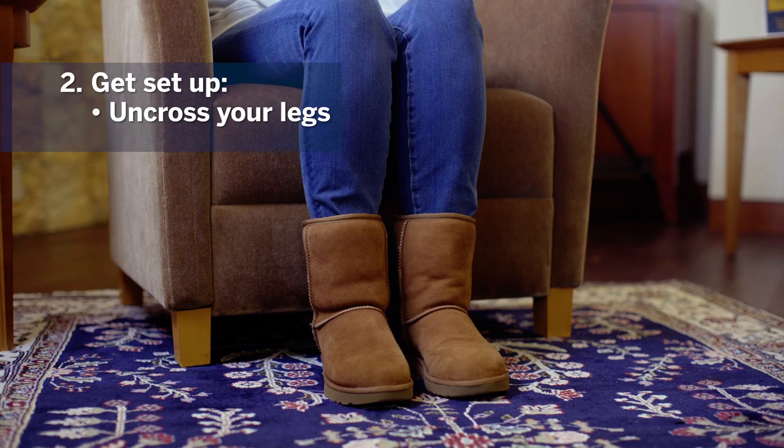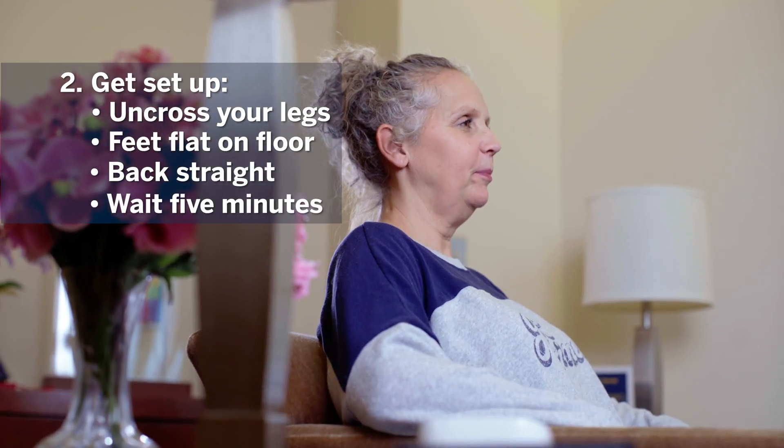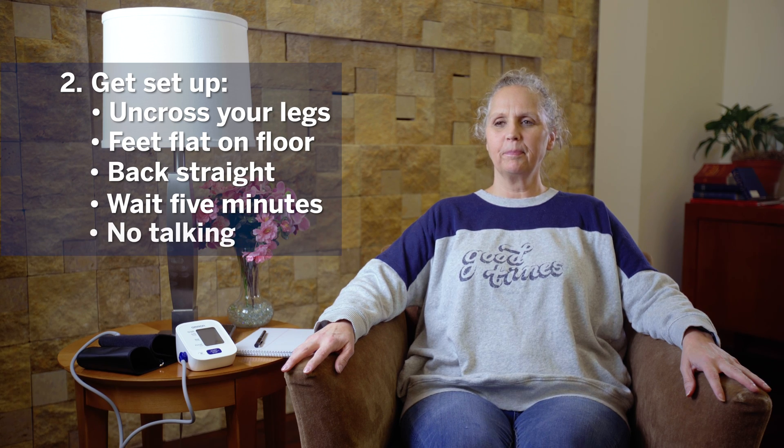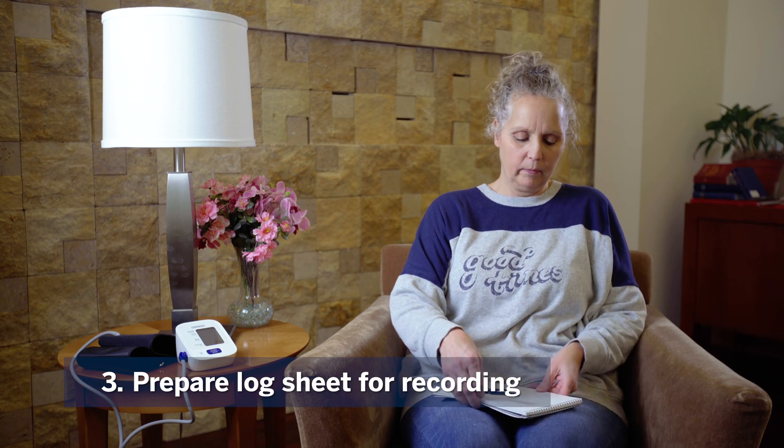First, sit down and relax in a chair that has a back. Uncross your legs, put your feet flat on the floor, and keep your back straight. Wait five minutes before beginning and try not to talk during this time.